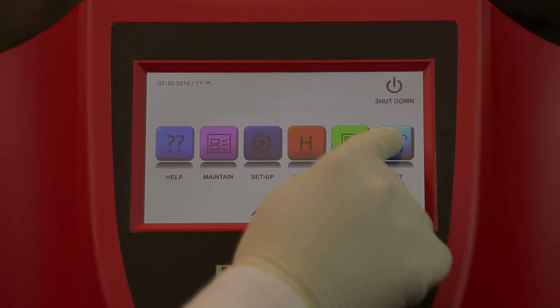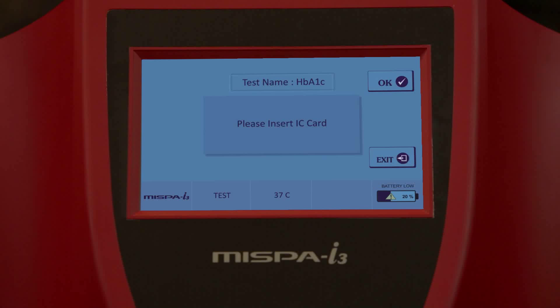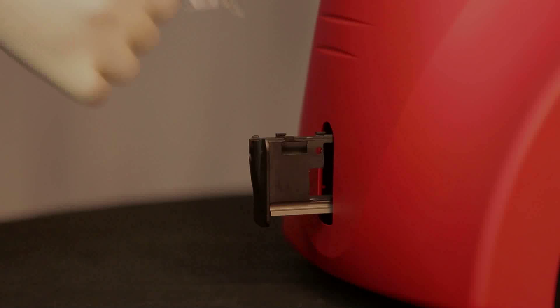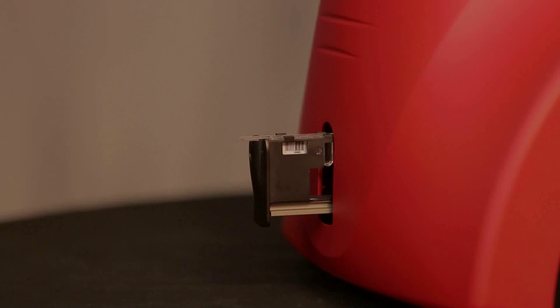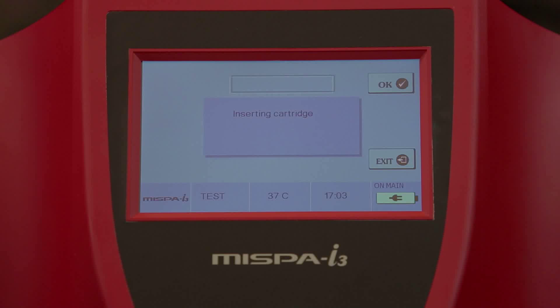To run the test, select the test function from the main screen. Insert the IC card for automatic calibration. Place the pre-filled cartridge of the specified test along with the sample in the carrier which comes out from the analyzer, and select the OK button. The analyzer will read the barcode label on the cartridge and display the corresponding test name with details.